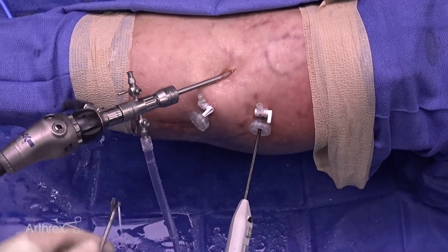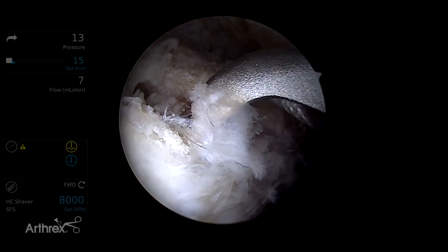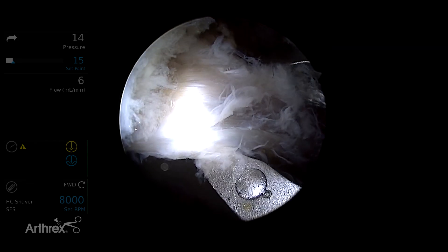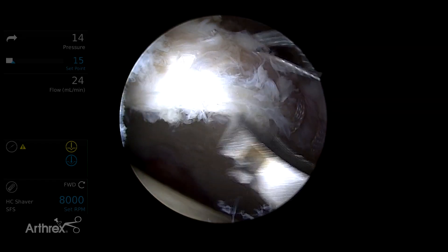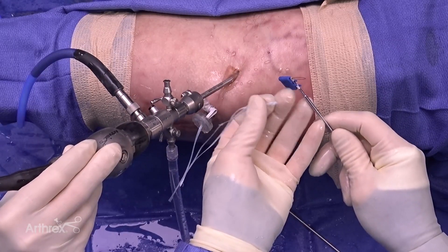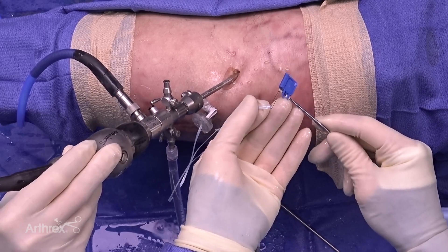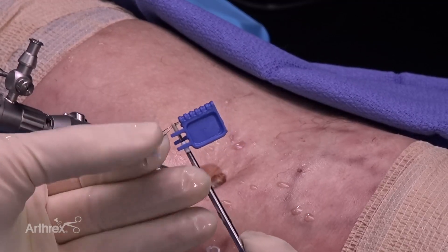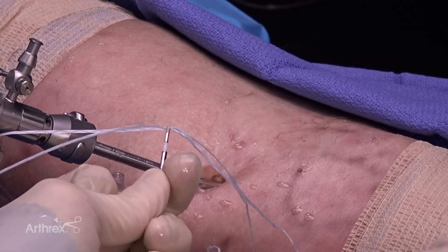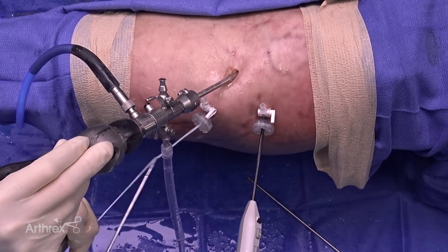This process is then repeated for the third anchor. The third anchor position is identified, again sliding off the acetabular rim to ensure you're not coming through bone. The suture is passed and retrieved. As you can see, the biocomposite anchor is small with a very minimal profile and excellent security. It is loaded simply with the suture tape and placed through — the suture tape passes very easily and is designed specifically for this purpose.